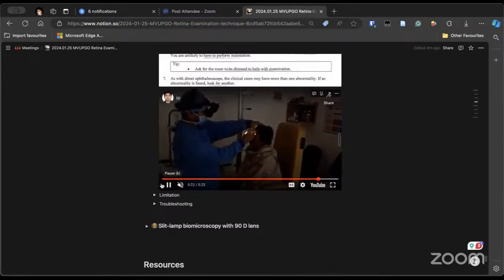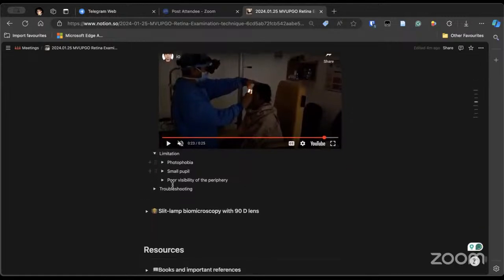Yeah. So I have a photo. I'll show you. So if the patient is having photophobia, how do I go about it? The patient is not opening the eye, not allowing examination. So what should I do? Reduce the illumination. Yes, and then maybe use a topical anesthetic and a speculum. Yes, and we can use filters also, a green filter. Yes, illumination, you can reduce the light.